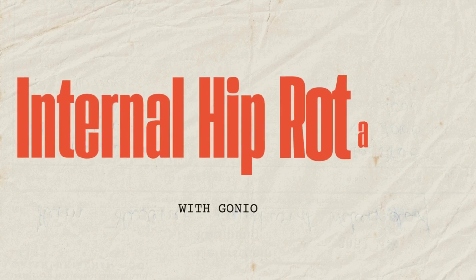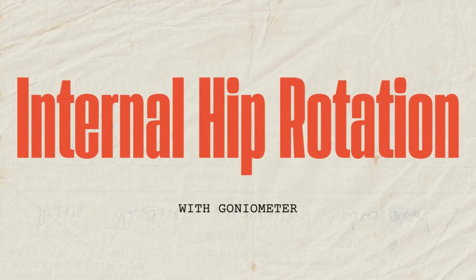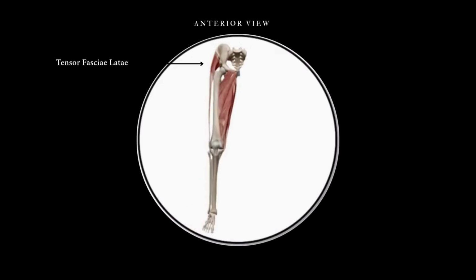Move on to the second movement, which is internal hip rotation. Seated internal hip rotation is a movement where the thigh bone, or femur, rotates inward within the hip joint. While seated with the hips and knees at 90 degrees, this motion causes the lower leg to move outward, away from the body's midline.